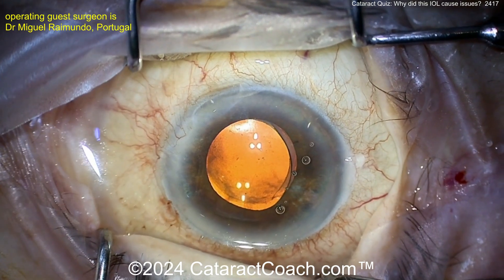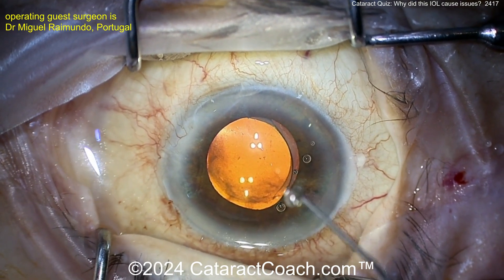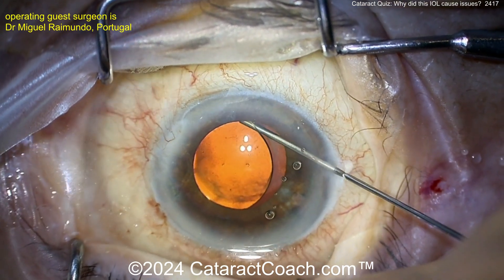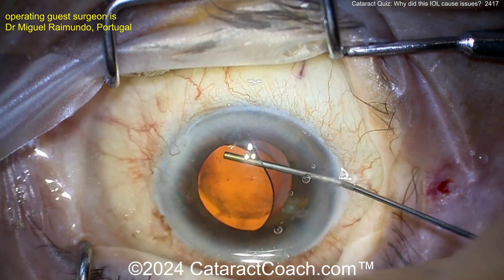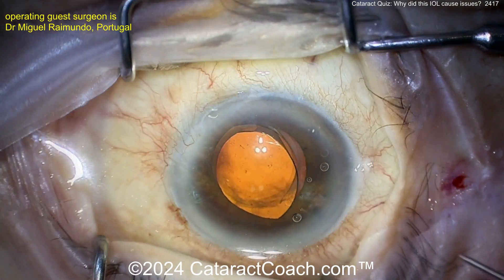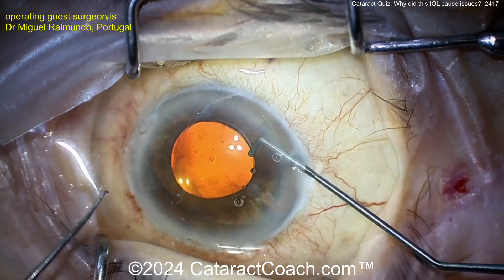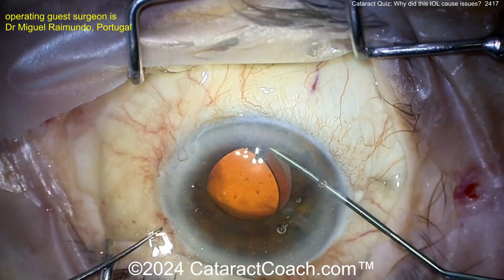There's a good reason we tell you never place a single-piece acrylic lens in the sulcus, because you'll get these issues. The haptics are so thick and they scrape the back of the iris — they're not appropriate for the sulcus. You want to use a three-piece lens for that.